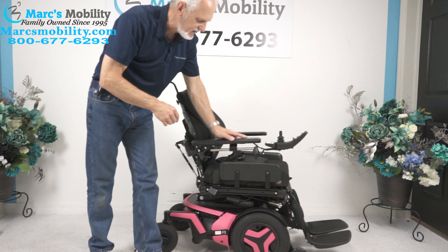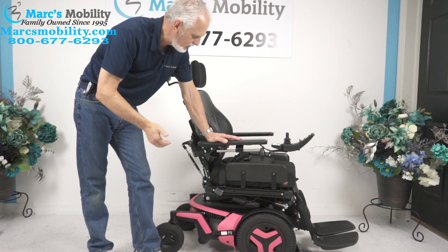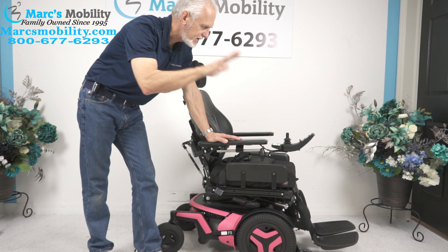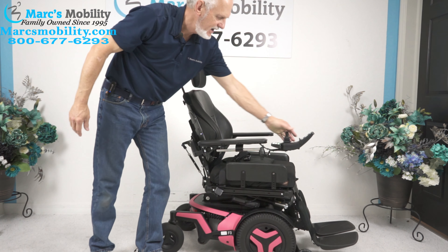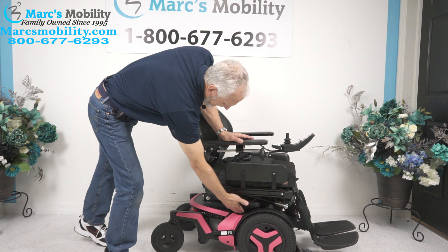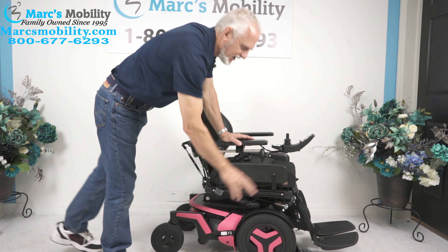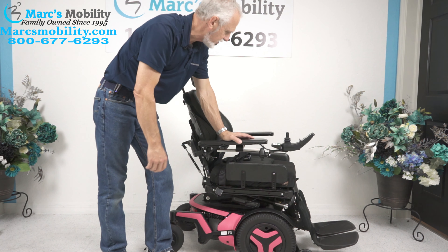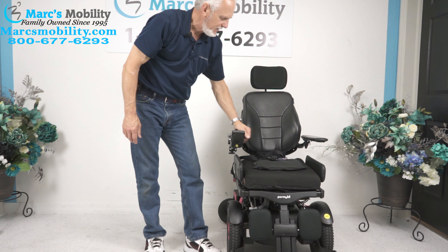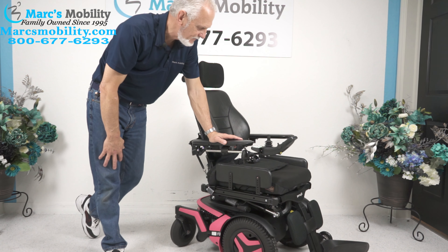Let's recap. This is a Permobil F3. It was used for about three months; it has 84 miles and is in practically brand new condition, pink in color. It has four electrical functions: a 12-inch seat lift, electric tilt, electric recline, and electric legs. It has the swing-away joystick and solid tires, plus this fantastic suspension. It also has four anchor points where you can secure the chair — in the front on both sides — to your lift or van for transportation. It has a 17 by 19-inch gel seat. The arms flip up. You have a safety belt. Just a great-looking, beautiful power chair, and it's ready to go.